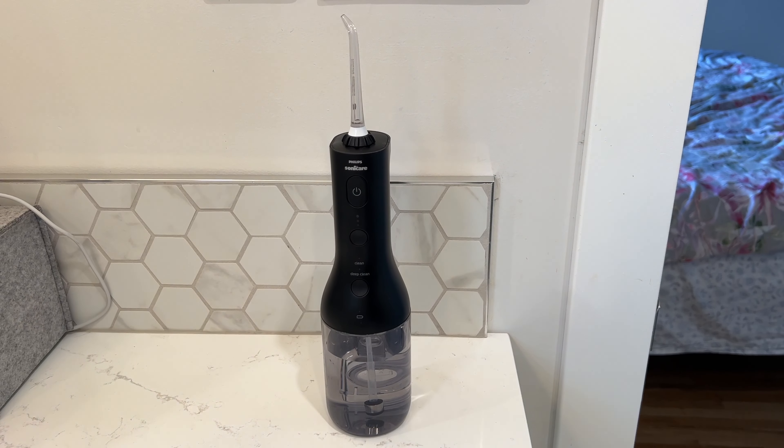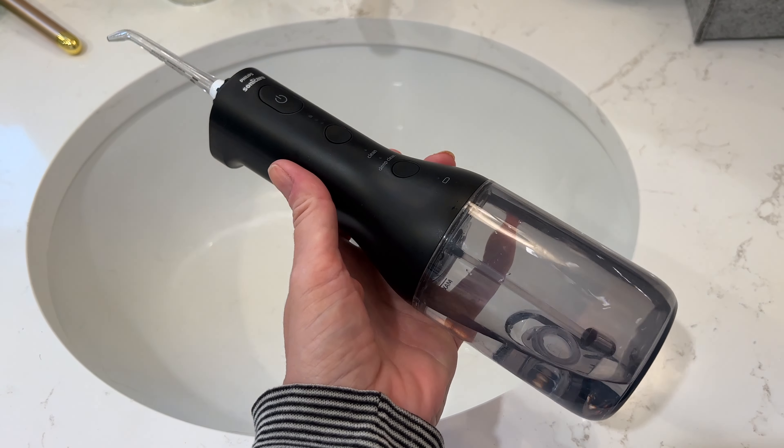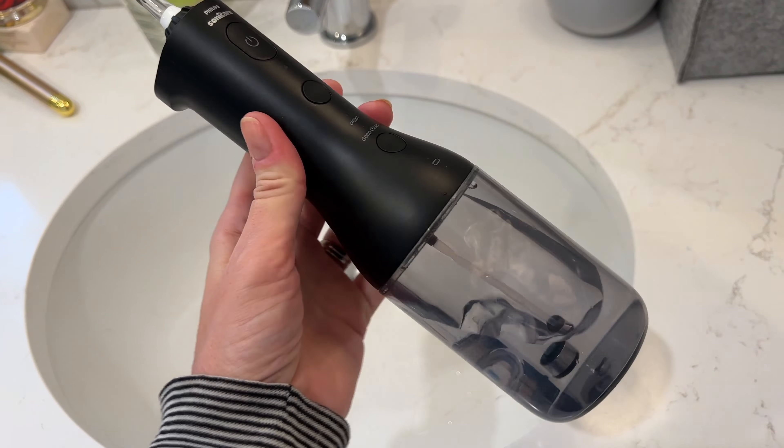Recommended usage is once per day. This unit is completely self-contained — there's no hoses or cords. While it is extremely big and kind of clunky, it's actually pretty easy to maneuver and it's well balanced in weight, so it's easy to use even when it's full.